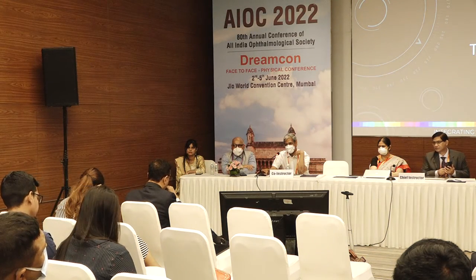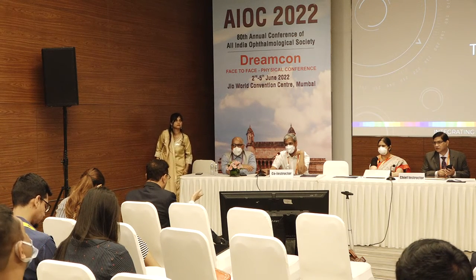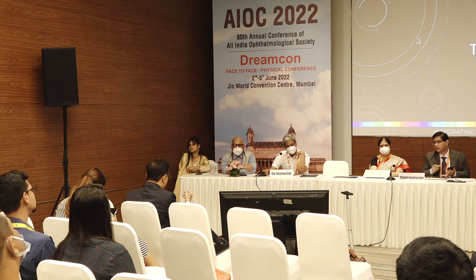Or less. The smaller the zone you measure, the more likely you are to be accurate. So you are suggesting in post-RK take the K reading from the Pentacam? Yes. Or whatever topography will give you the central 2 millimeters or so. Optical biometers also do that, right? Yes. They are more accurate, in fact. I'm using Anterion, and Anterion is also a topographer. It gives different zone readings. Yes, like TOMI, it allows you to calibrate the zones, how much you want, whether you want 2, 2.5. Smaller zone. Yeah, smaller zone. Right, thank you.